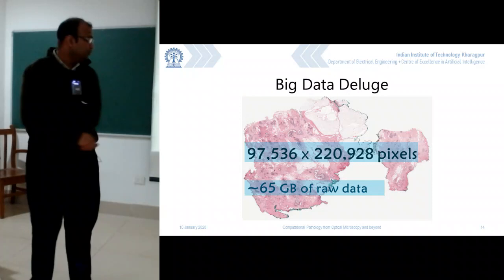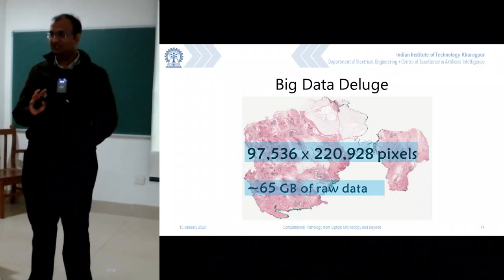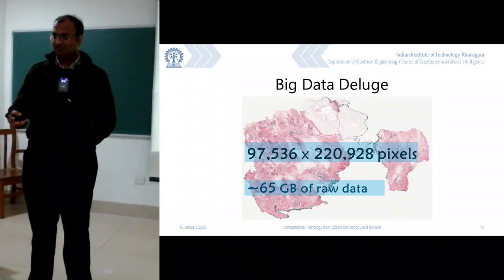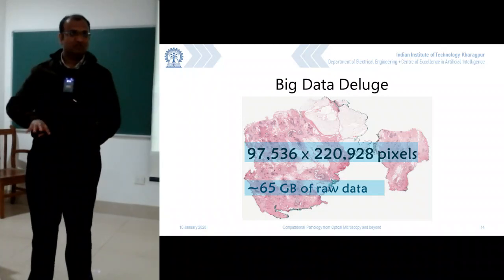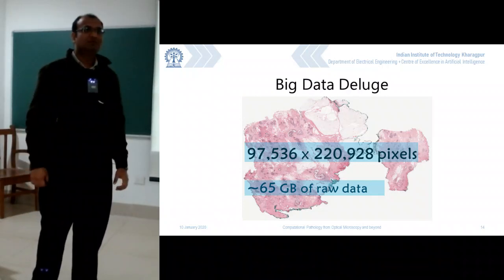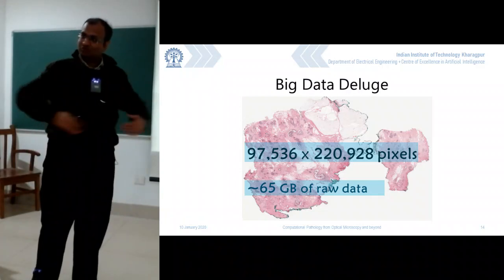So the moment you extract some information out of it, the image does not remain an image anymore. It's going to be something else. Now for a histopathologist to infer, he would need something like an image. And it had taken us almost 25-30 years to make them come to a point where they are okay to browse an image on a screen and tell, instead of looking through that optical binocular eyepiece. And I have lived through that.